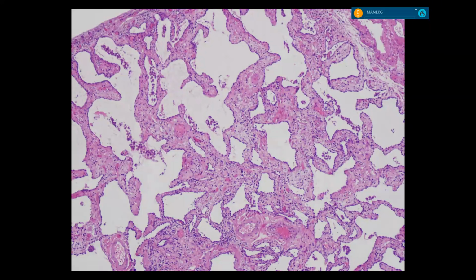The blue dots are all lymphocytes. So there's no separation between normal and abnormal. They really should give you that if they're trying to show you UIP. If there's no separation, then they're pushing you towards NSIP. And then the age will be different: they'll give you an older patient for UIP, a younger one with NSIP. Hopefully they'll give you some CTDs. Make sense? All right.